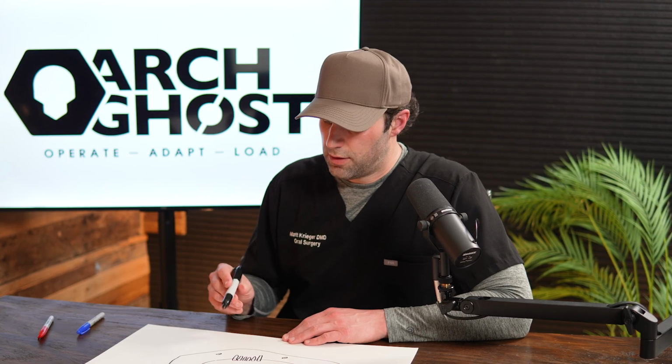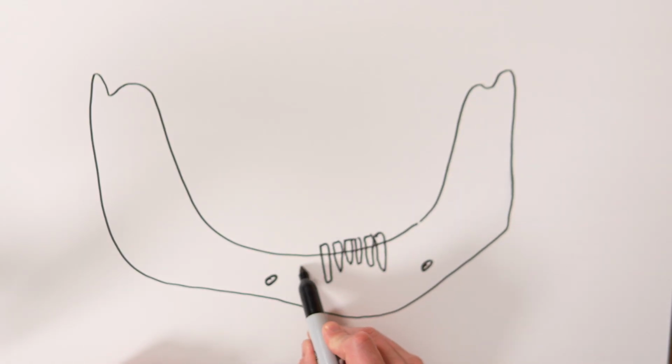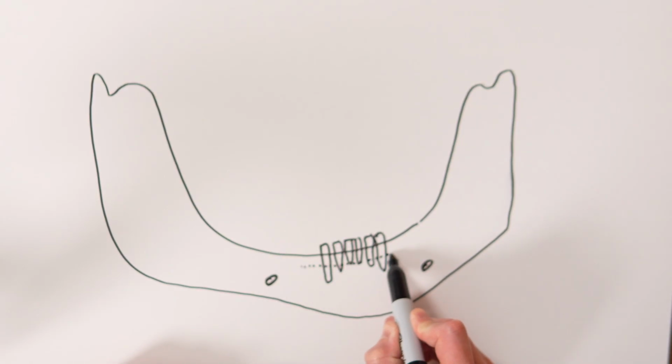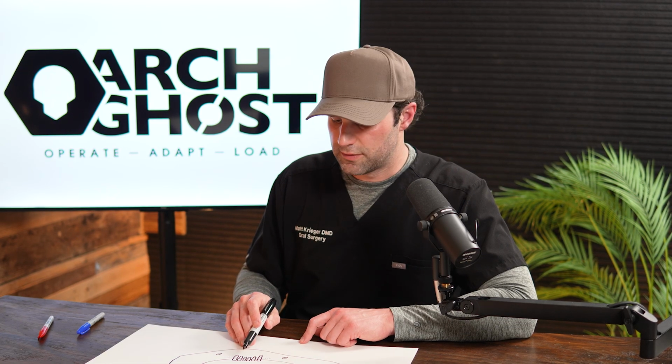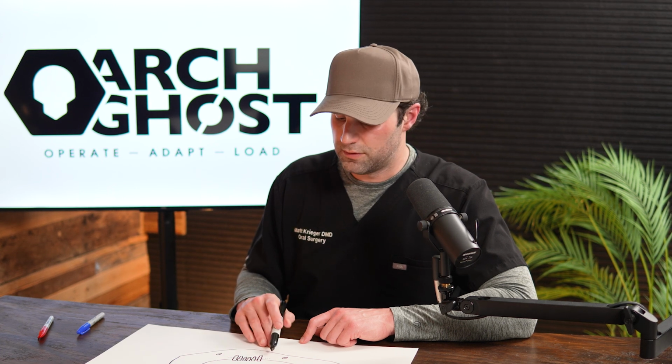Almost always, when you perform your reduction, if you are going to be to an adequate depth of reduction for the average prosthetic, which is typically at least 15 millimeters of space, you are almost always going to reduce to the point where you've completely eliminated the central incisor sockets. You may have a small amount of the lateral incisor sockets available, and you'll have the canine socket, obviously, it's so long. But those central incisors, they're almost always going to be gone.